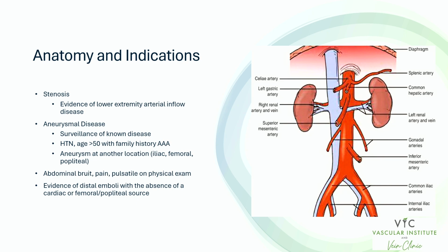The biggest thing that a sonographer needs to know when overcoming any challenge in the abdomen or doing anything is be very familiar with the anatomy. I threw some indications in here, but Tish did a good job covering aorta imaging and why we would image that. But you need to be very comfortable with your landmarks, why you're doing the study, and the anatomy.